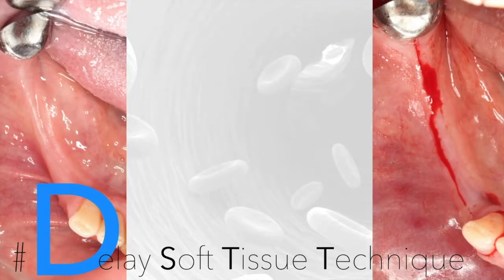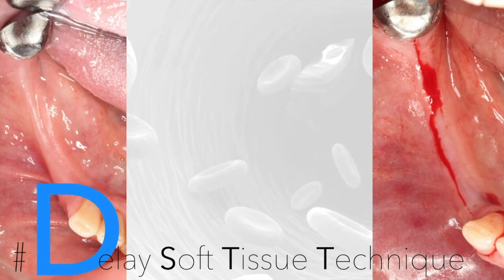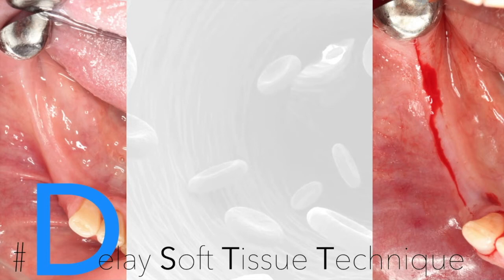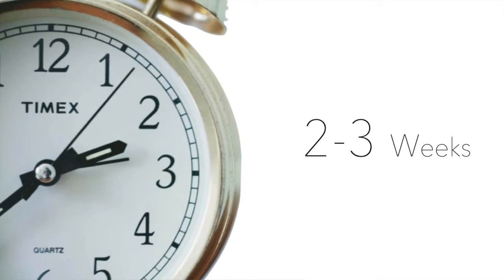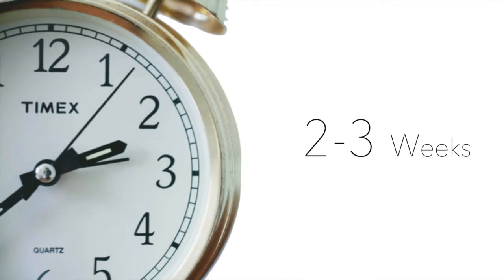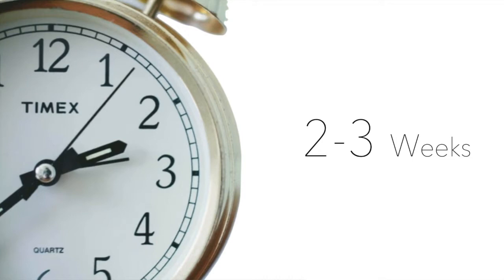We perform the delayed soft tissue technique with a crestal incision and intrasulcular incisions, one tooth mesial and one tooth distal from the defect. We elevate a full-thickness flap and close it with single sutures. This technique takes 10–15 minutes and is performed to increase the vascularity of our flap. We then wait two to three weeks before starting bone reconstructive surgery.